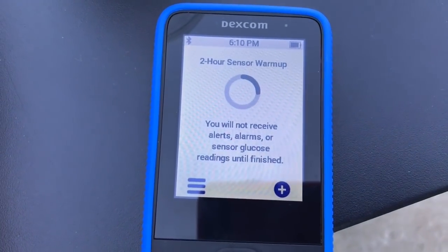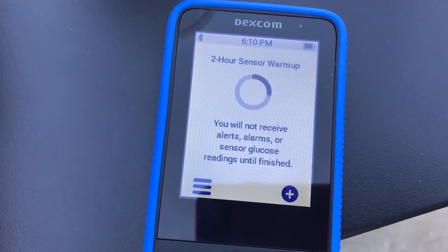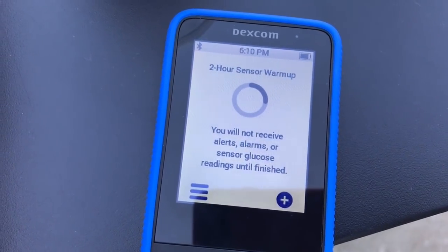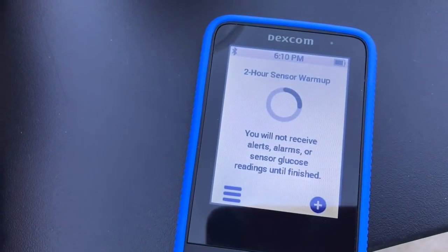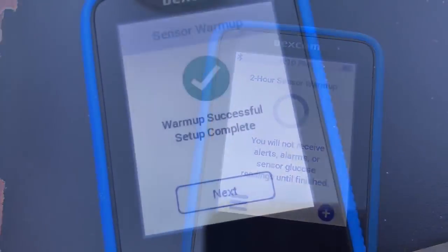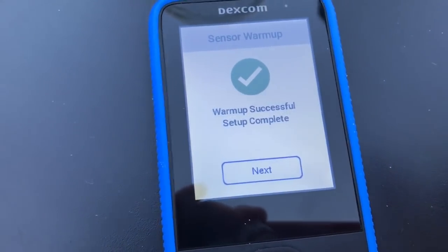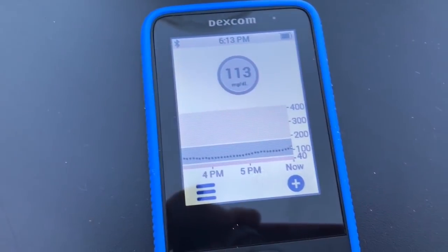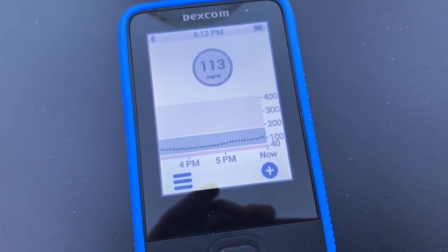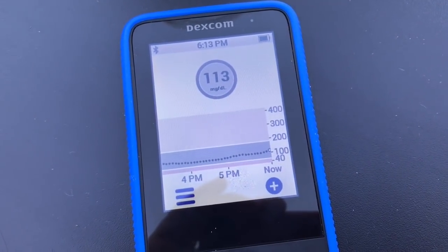There we are. Now we have the two-hour warm-up. Notice it shows a pretty big sliver left, but really it's only five more minutes, and then we'll get back onto the session — and the phone is still recording blood glucose readings this whole time. There we go. Since our warm-up is done, got the message, and we're back in business. No calibrations needed. We used the code, and all good.